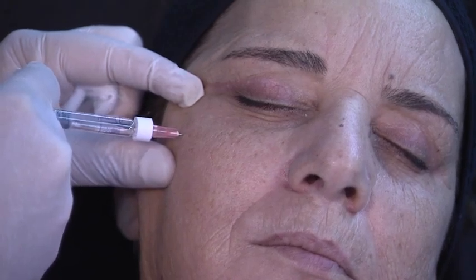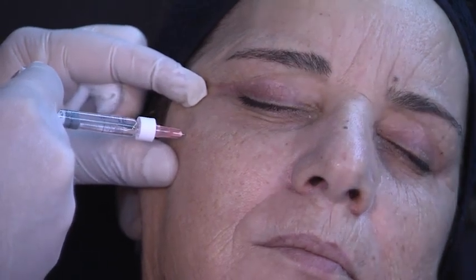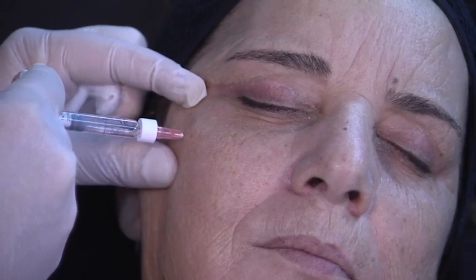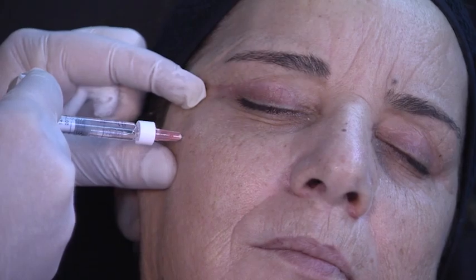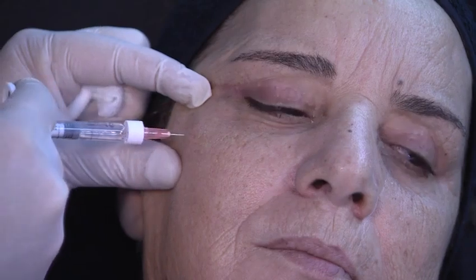Because Restylane Lift is a hard product, I'm going to go very slowly, so the patient can feel a little bit more than with OBT while we are infiltrating the product. Look at the speed of my infiltration. It's quite slow, very slow. With 0.1, I'm not going to do anything here. I need a little bit more because the priority is not to volumize. I'm going to inject more product lateral than medial. So I have one there. Wait. Look at that projection here. We are starting to see a projection.